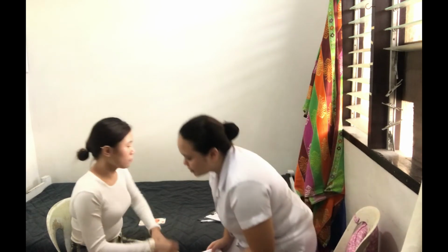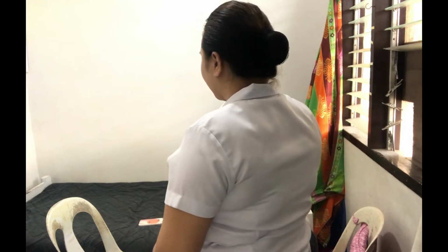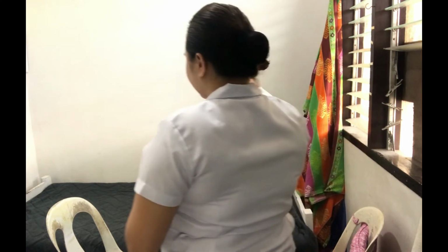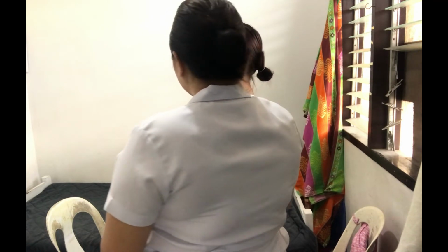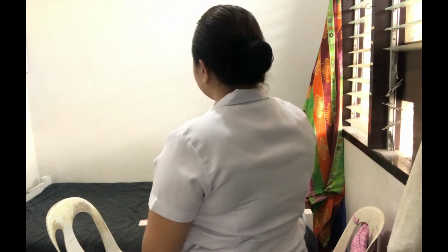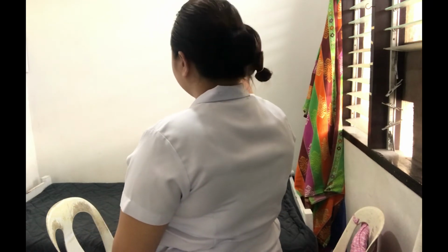Ma'am, may I ask if you wear contact lenses or graded glasses? No, nurse. Ma'am, may I invite you to stand up? Now, I want you to use this cardboard to cover your right eye, then your left eye, and then both of your eyes. Try to read the letters written in the Snellen chart, up until the letters you can still see. Is that okay, Queen? Yes, nurse.